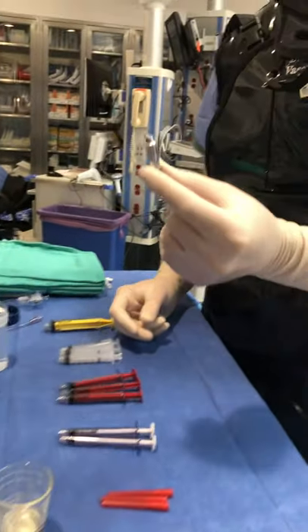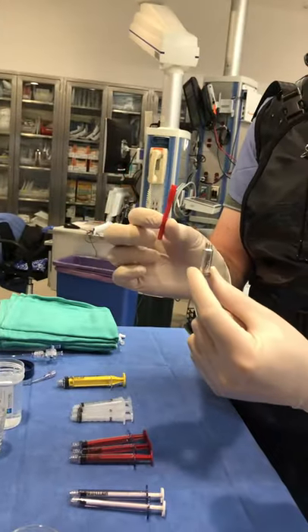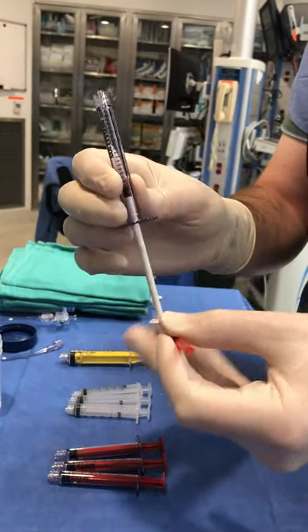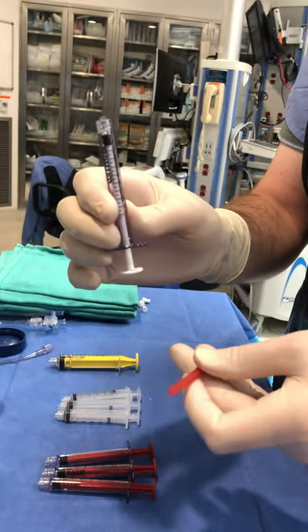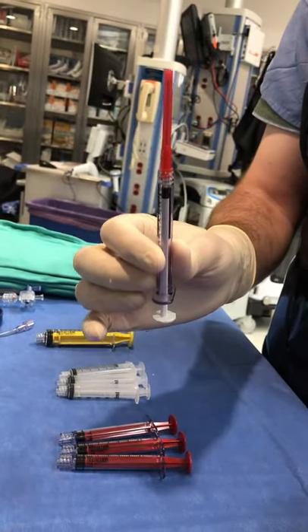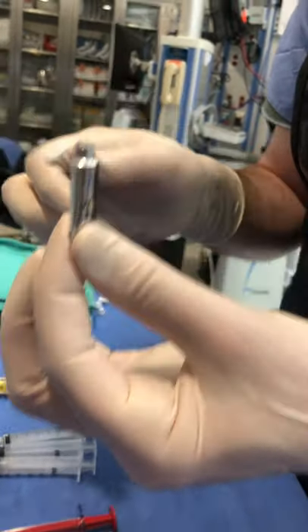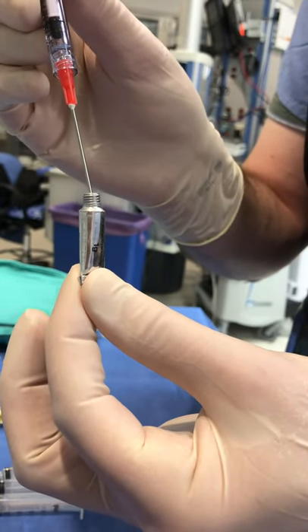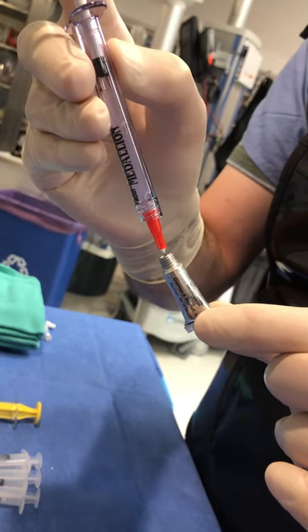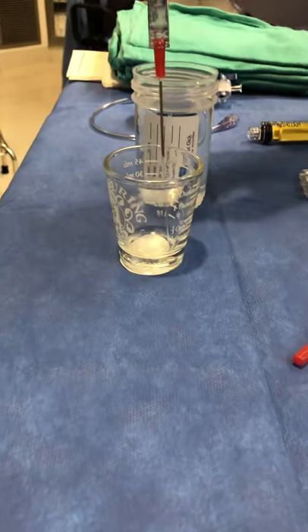You always come with one cc of NBCA glue, made by Codman. We always use the disposable blunt tip red needles. You have to make sure the syringe is the hard plastic one — the polycarbonate. A new needle and syringe for every step. The needle cap comes off — hold but don't squeeze the glue. The needle comes straight down through the top into the corner of the vial, and you just lift up very slowly with your finger until one cc comes out, and it goes in the mixing glass container.